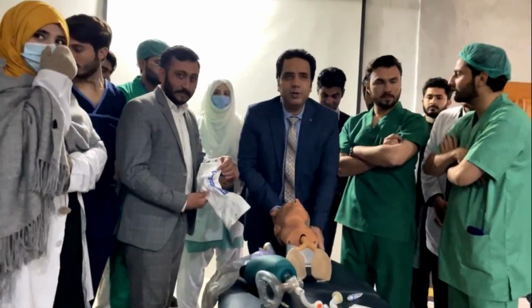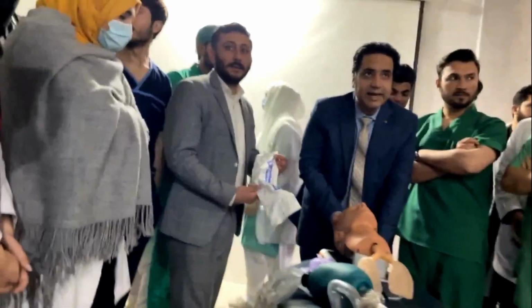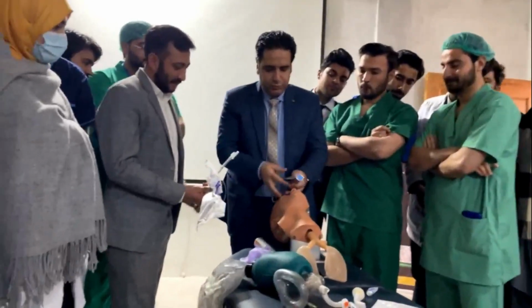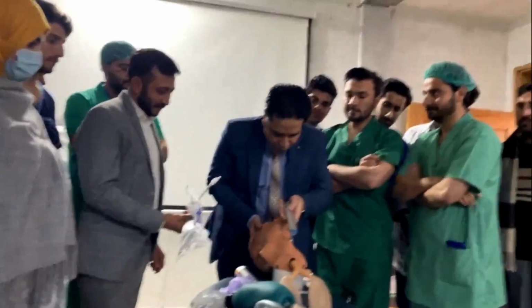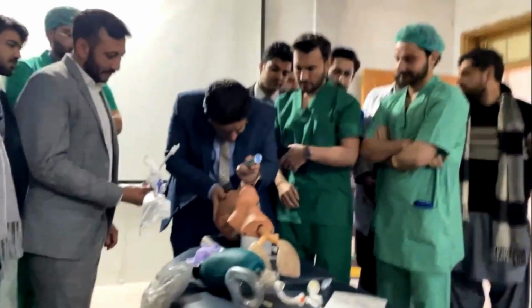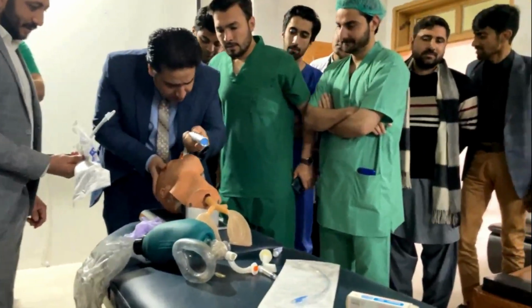First of all you will do the neck extension. So this is the neck extension. Then you will go from the right side towards the left side.